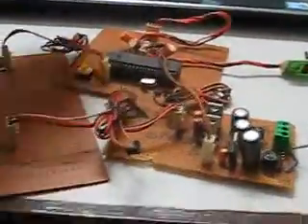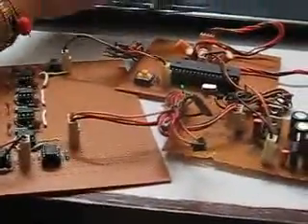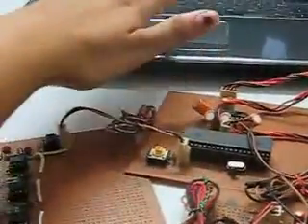So this is our DAC system, and using the sixth order Butterworth filter, we are getting the signal like this. This is the ECG signal of the normal patient, and we have to process the ECG signal in LabVIEW for getting a clearer view of it.